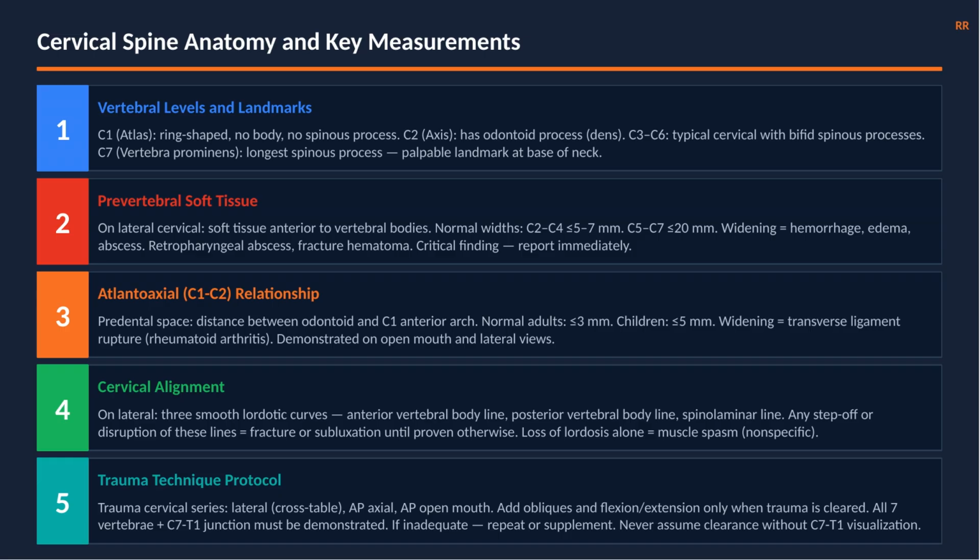Trauma protocol. Cross-table lateral first. AP axial second. AP open mouth third. Add obliques and flexion/extension only after physician clearance.